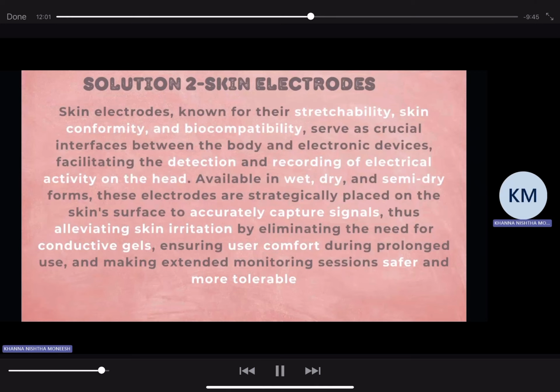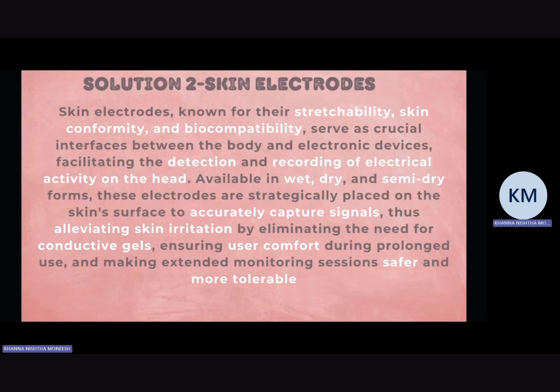The second solution are skin electrodes, which are known for their stretchability, skin conformity, and biocompatibility. They come available in wet, dry, and semi-dry forms. These electrodes are strategically placed on the skin surface to accurately capture signals, hence alleviating skin irritation by eliminating the need for conductive gels, ensuring user comfort, and making monitoring sessions safer and more tolerable.